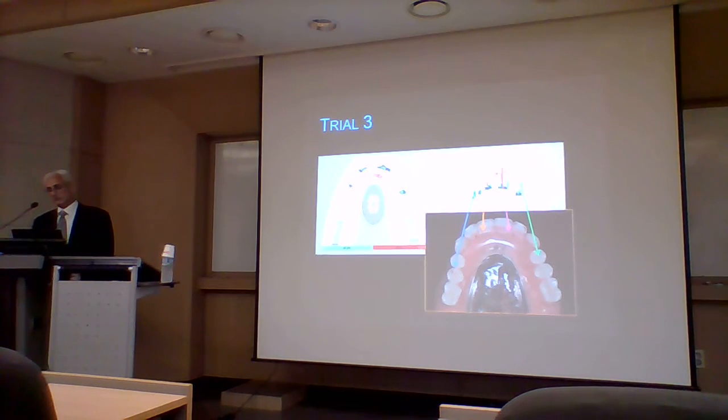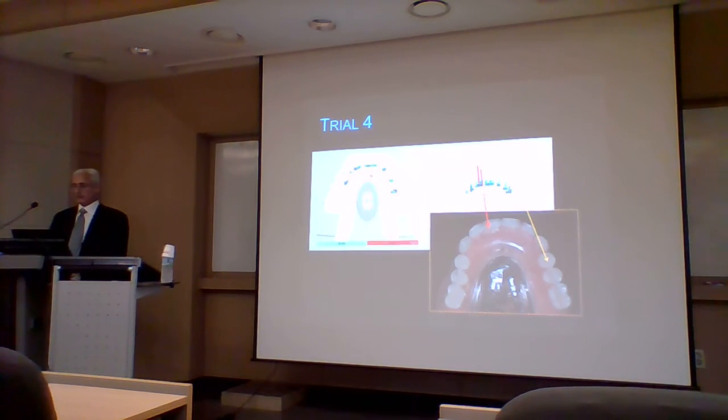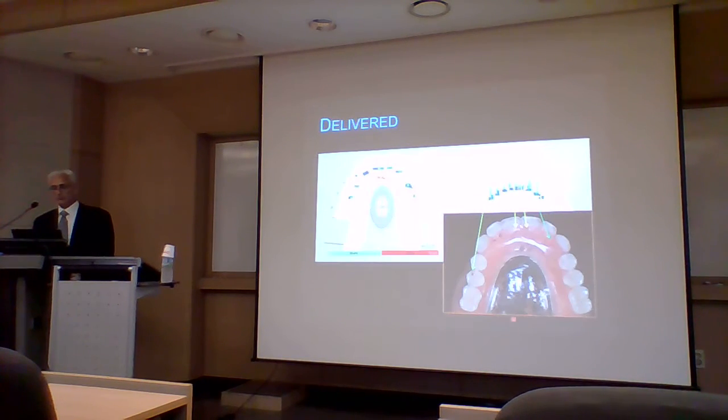And again, the T-scan will illustrate where the high pressure is versus the low pressure. And then we adjust again. And ultimately, by going through this kind of process of choosing only the mark that matches the highest force or the next highest force, we can end up with a fairly uniform force distribution.